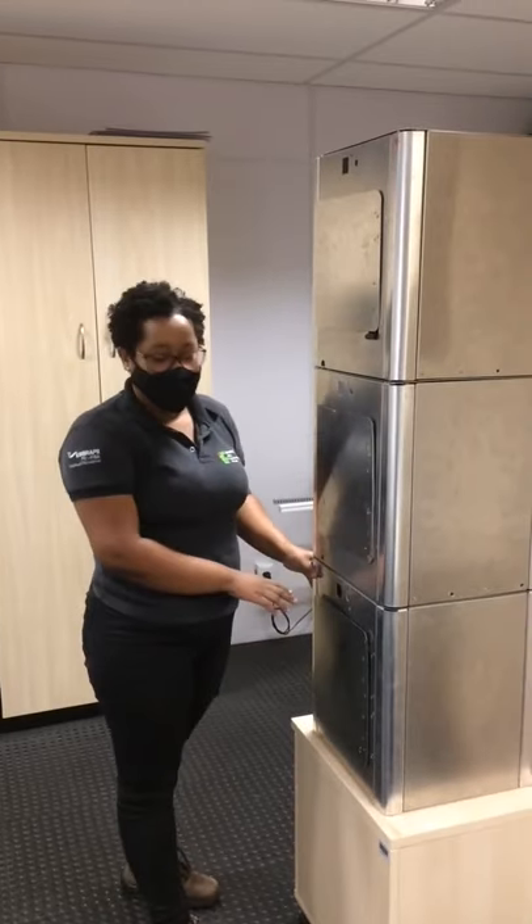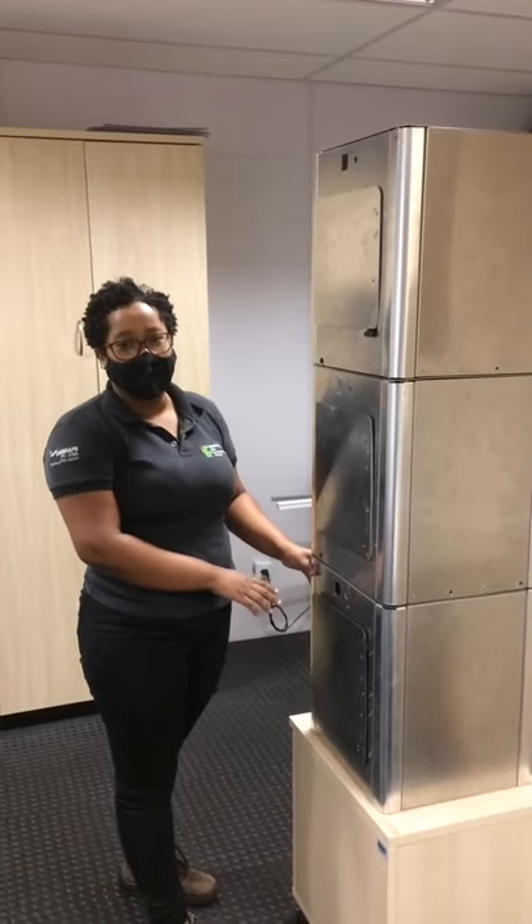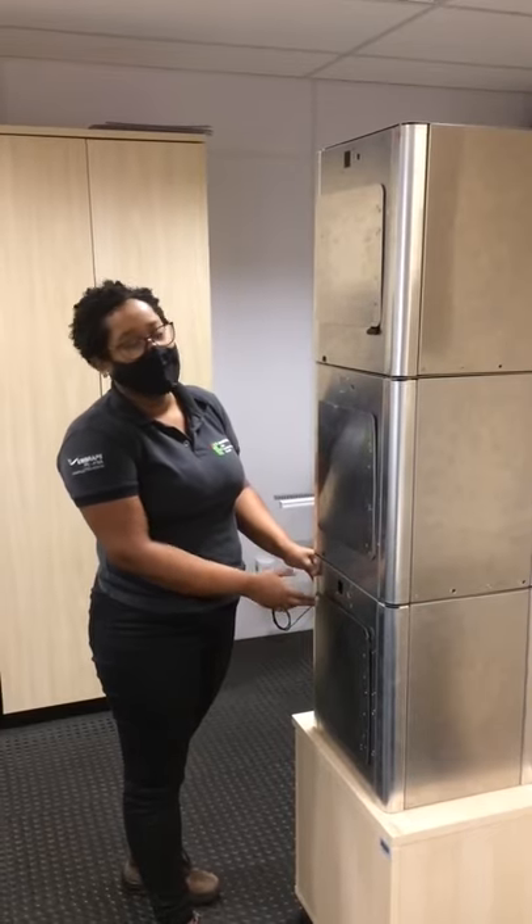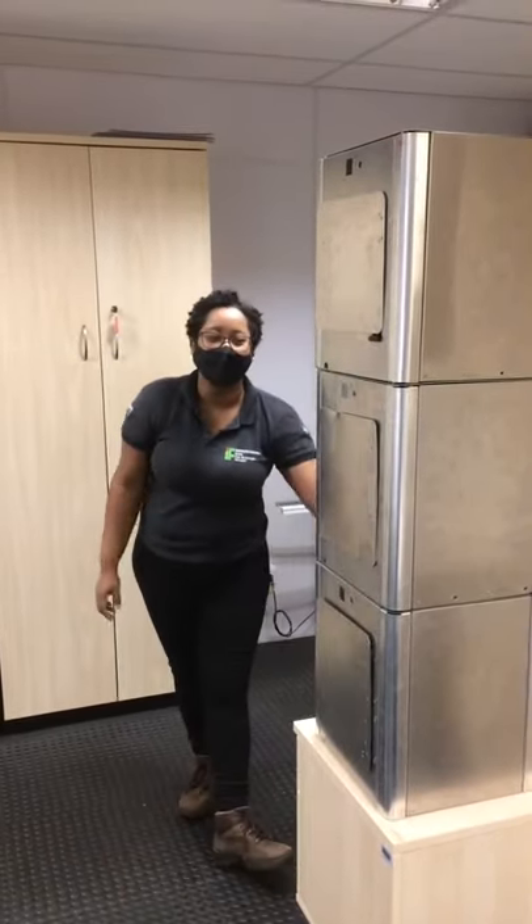A gente tem um módulo mestre que está com duas portas. Ela tem a porta de entrada de equipamento de material contaminado e a porta de saída aqui no fundo.